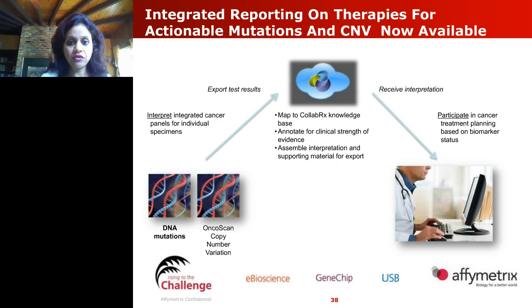That is correct. For the vast majority of the samples that we run, about 80% of the samples, we have a solid tumor algorithm that looks at the fraction of diploid versus non-diploid regions genomically and is able to calculate, therefore, from a genomic perspective, the % aberrant cells or the % tumor cells in the sample and give that number to you.